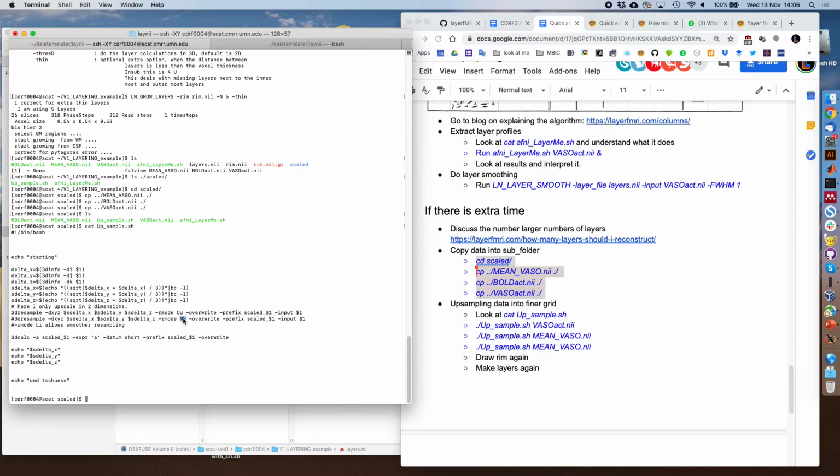But there is blurring, obviously, so would it be preferable to you that they were not modeled as blocks, but instead as Gaussians? I think it would be more accurate. I don't know if Gaussian is the best, or some other interpolation function, or Lorentzian because it's k-space. I don't know, but it's a strong assumption to assume that it's homogeneously filled.